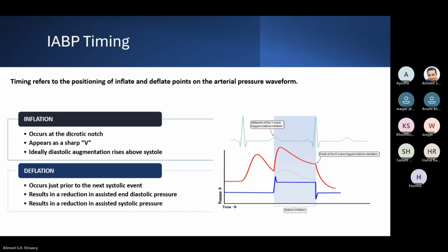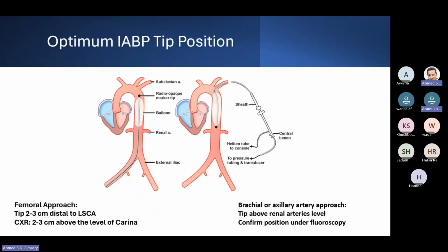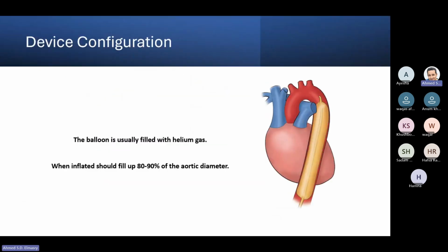You got it? The balloon is inside the aorta. So I am telling you about the occlusivity. Okay, so this is the aorta, and this is the normal diameter for the aorta. So if you have vasoplegia, what will happen?